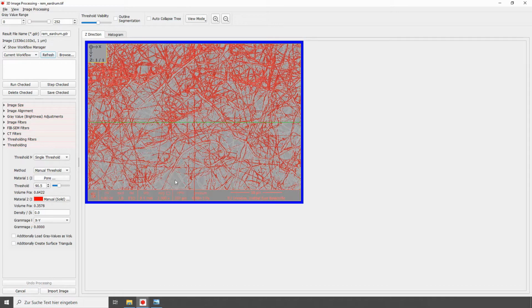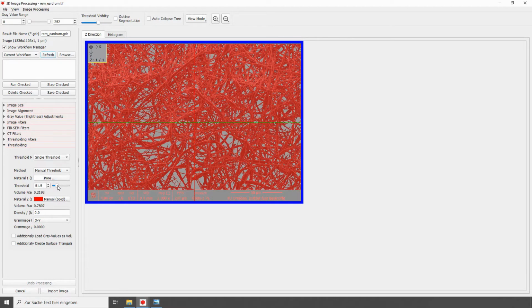As you can see, a lot of fibers are lost here, so we have to reduce the threshold a bit. This also allows us to segment the fibers that are in the background. Of course, you can now clearly see that the fibers in the foreground, where sometimes several fibers are parallel, are melting together. However, since we only want to analyze the orientation of the fibers, we can ignore this at the moment. With this threshold, we should get a useful result. By clicking the Import Image button at the bottom, the segmented image can be imported into GeoDict.